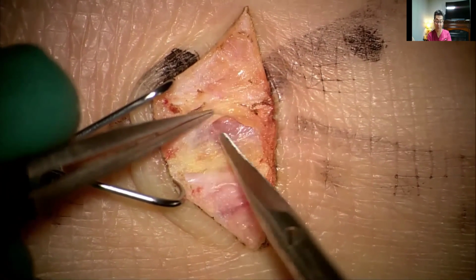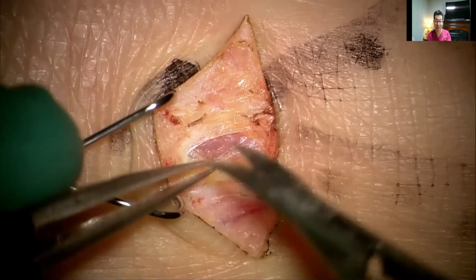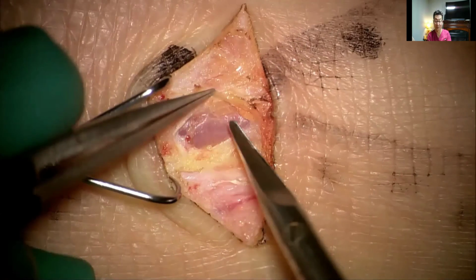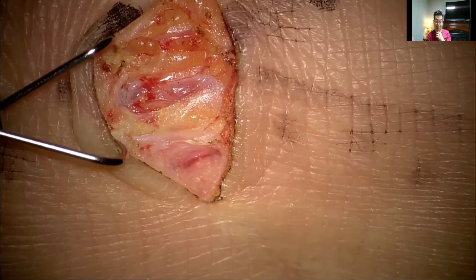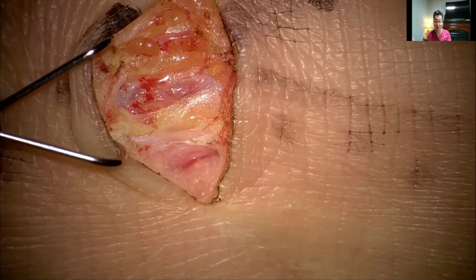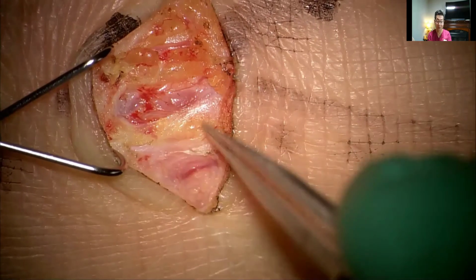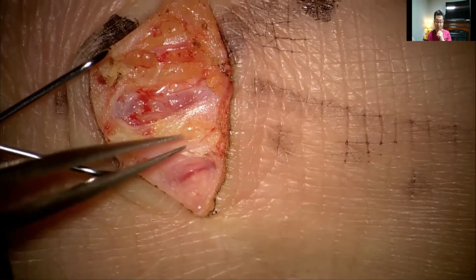We also like to use a different dye. We use a fluorescein dye, which comes up yellow, and you can see the shadows of the yellow lymphatics within that subcutaneous fat. Once you've identified the vein, we go ahead and start to identify the lymphatics, and you can see that it correlates very well with the dotted line, also with the linear line shown to be the vein structure.